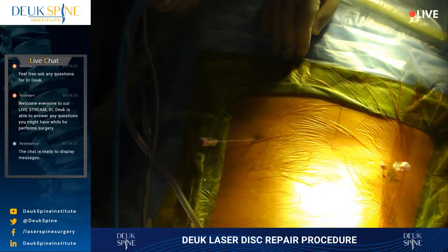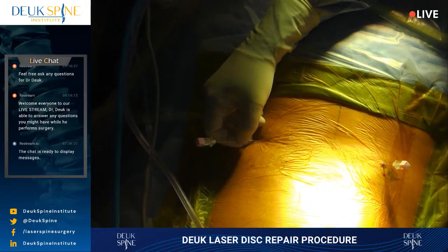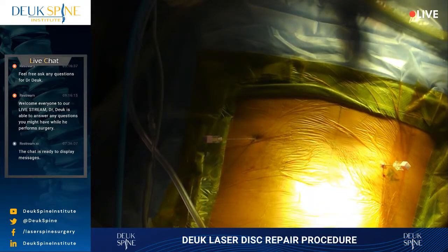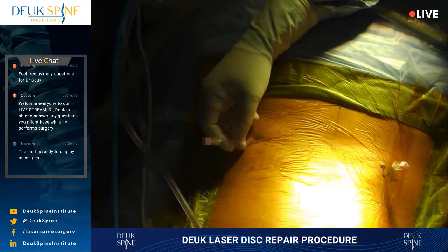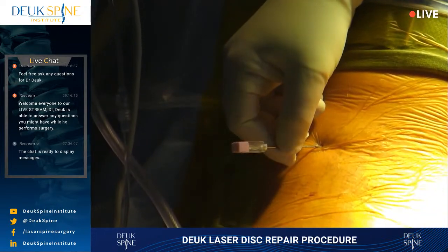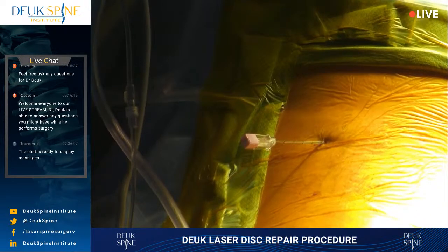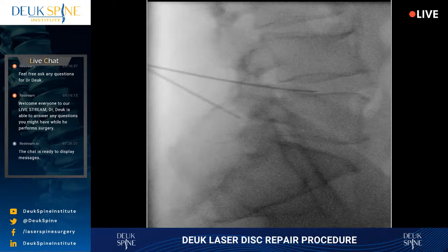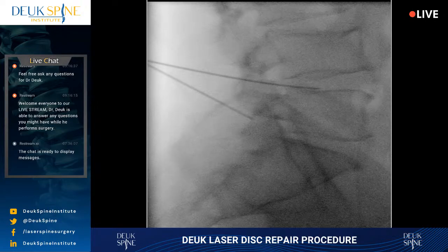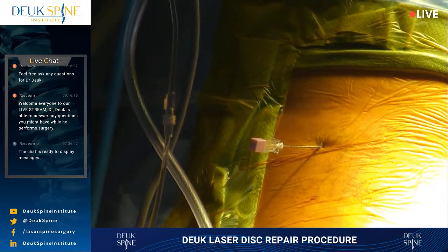Okay. Are you comfy? Sarah, you comfortable? Sarah? That's fine. Yeah, I don't need Sarah's cooperation this very second. So just keep Sarah comfortable. Sounds like Sarah is comfortable. Sean? I will need it soon, but not right now. All right. Let's get an AP view shot and then AP.